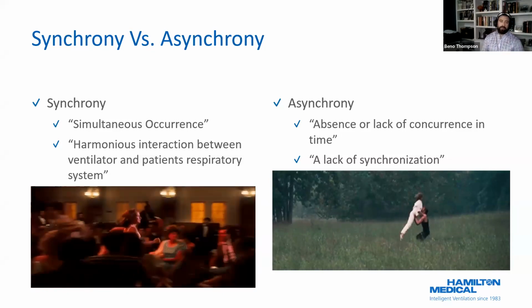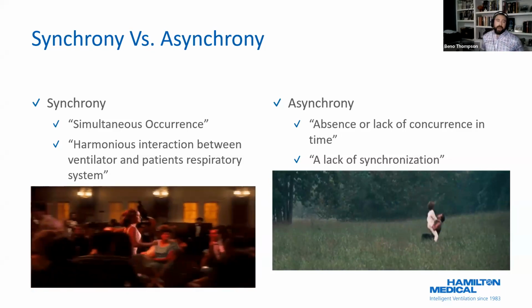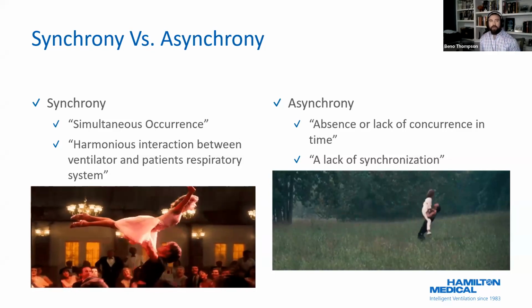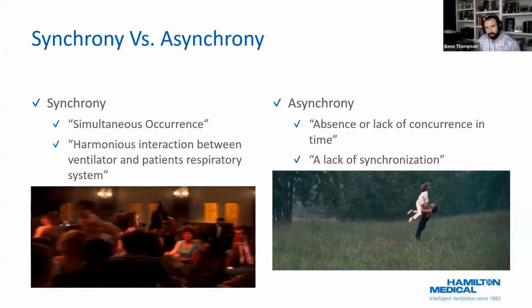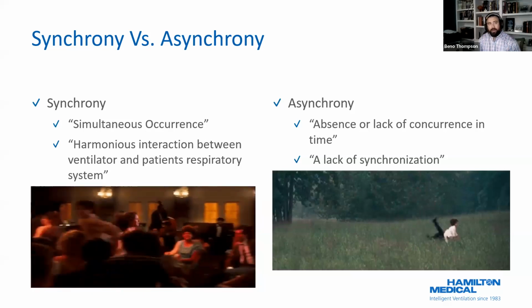In this case, we're talking about the patient and the ventilator. Asynchrony is the opposite of that. It's a discordant relationship between two entities, a chaotic relationship, if you will, a lack of synchronization. I've got it depicted here using Dirty Dancing as an example.